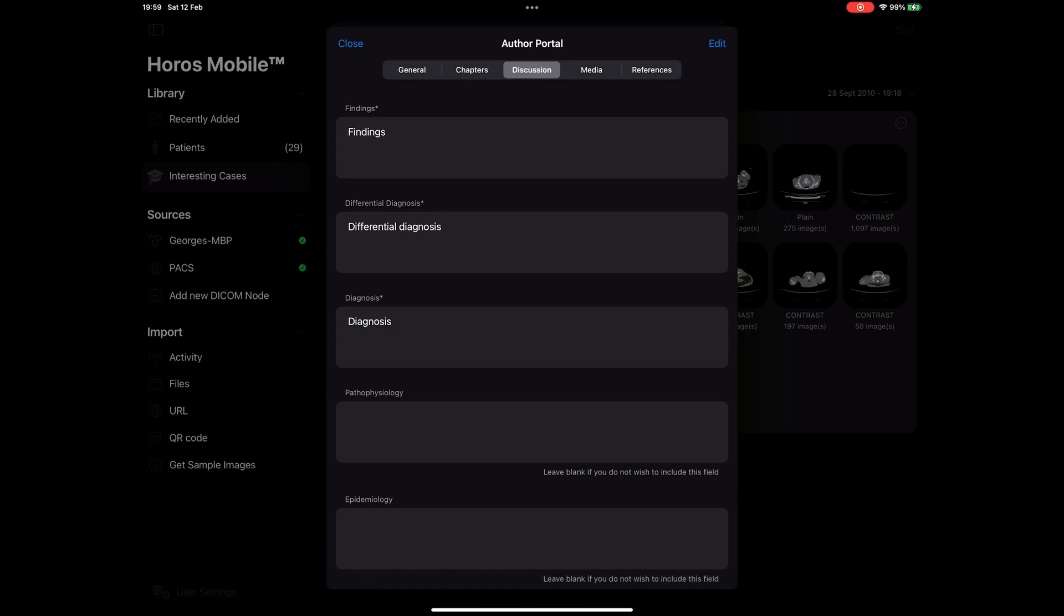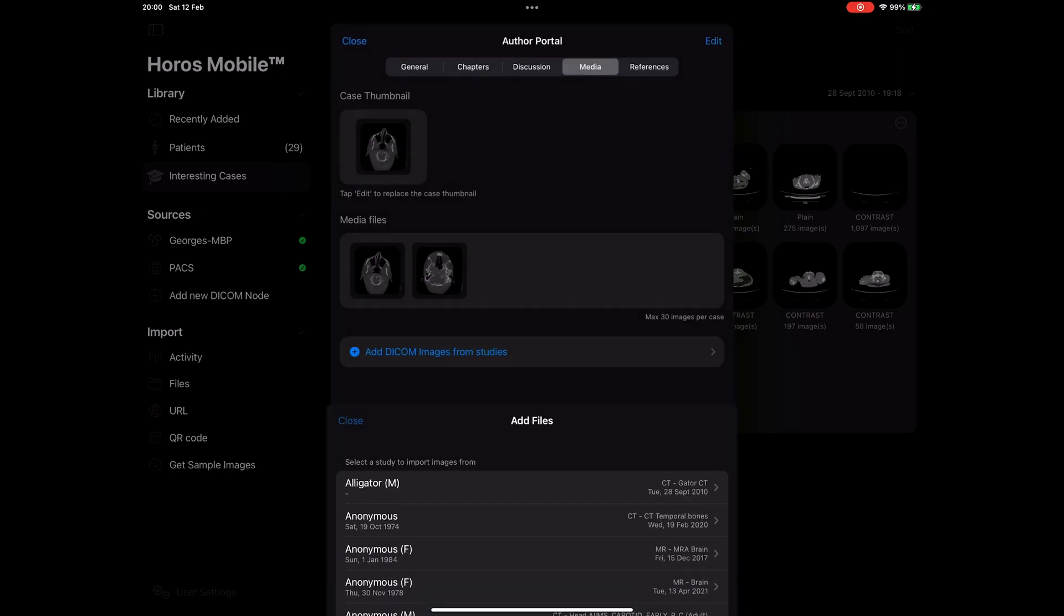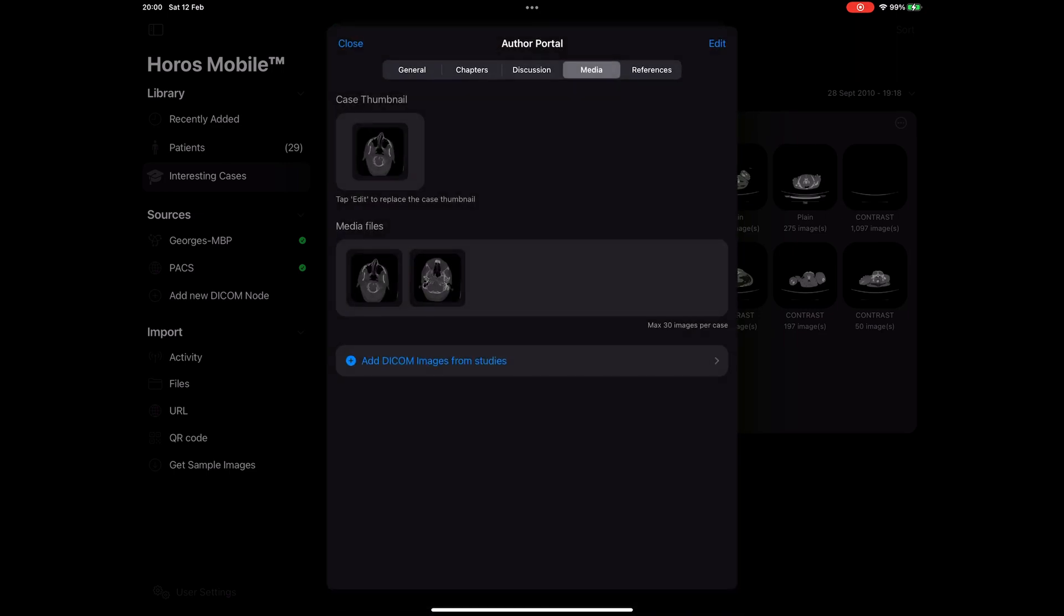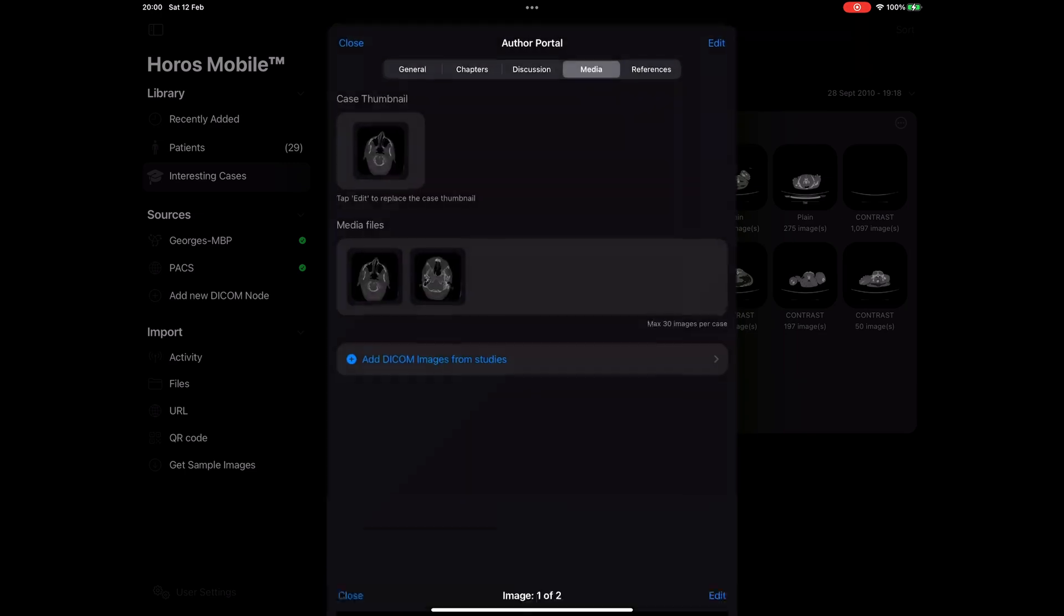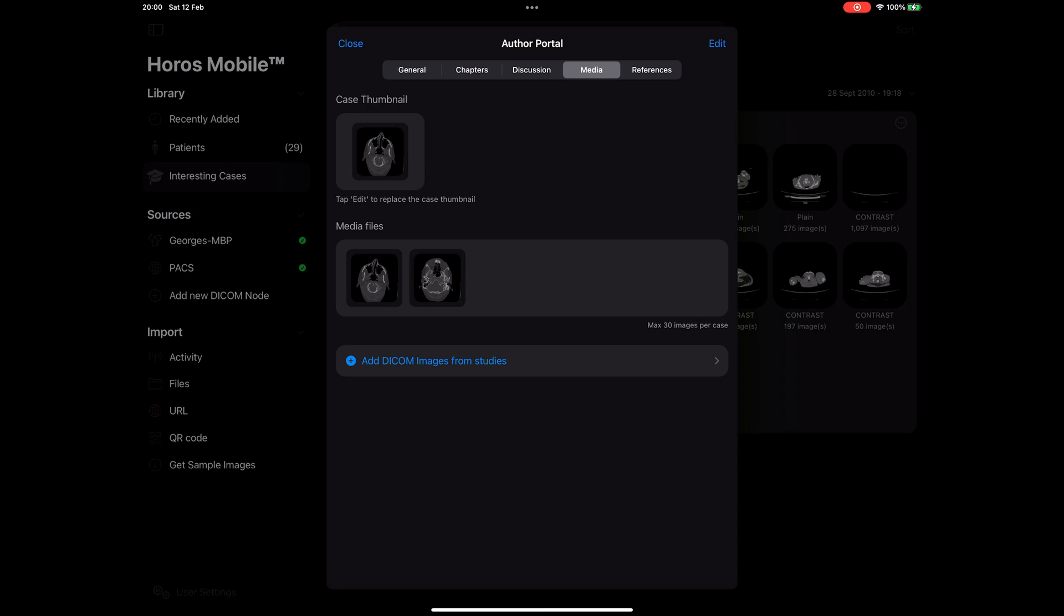In the next tab, which is called media, I can manage my media files. I can add more images to my case and use them in different chapters or set my case's thumbnail. By default, the first image that I import is going to be my case's thumbnail. Let's go ahead and change that. Tap on the edit button and select one of the images below. I think I like this one.